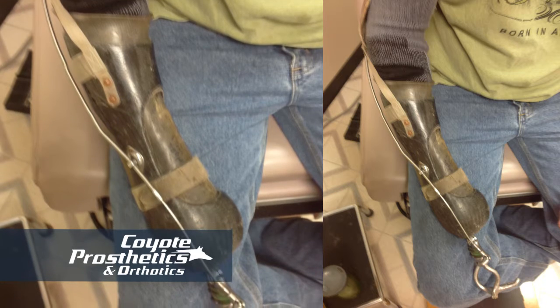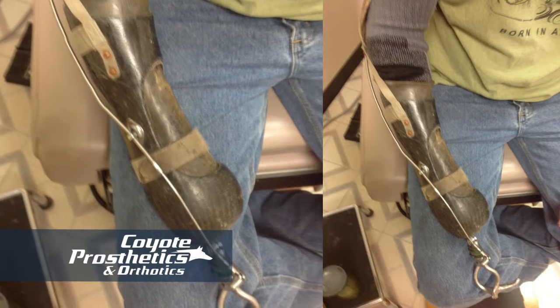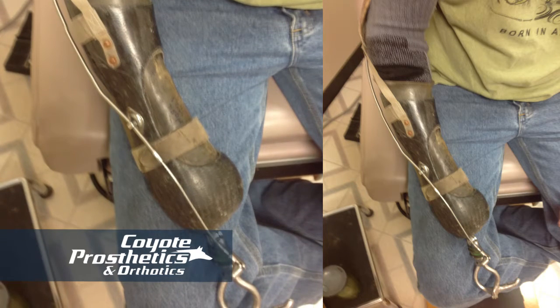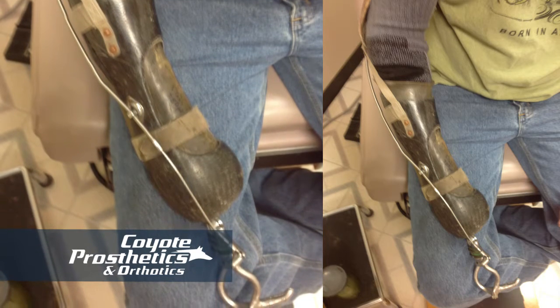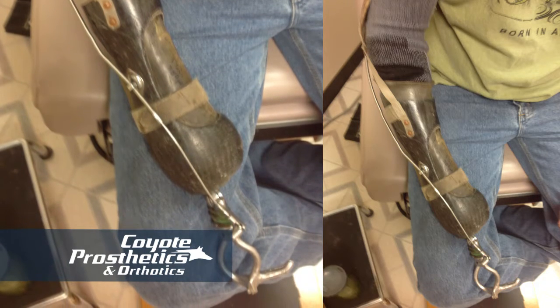I use the claw all the time. I use it so much that I forget — it's just part of me. Even when I went to Ohio to get this made, I'd show up with my claw on. And I didn't need to — there was no reason for me to have it on — but it's just become a part of me. I use it for everything, everything. And I always have it on.